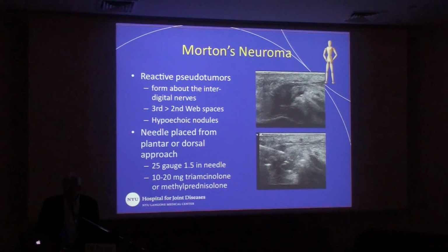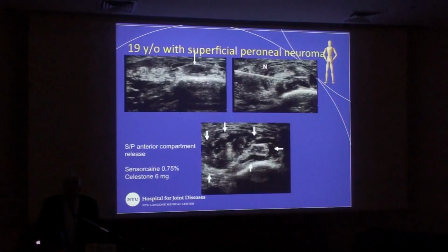And so that's what this would look like. Here's my needle within the neuroma, and you notice the neuroma looking more echogenic because of the contrast effect that we mentioned earlier. The same thing would be true for neuromas elsewhere.